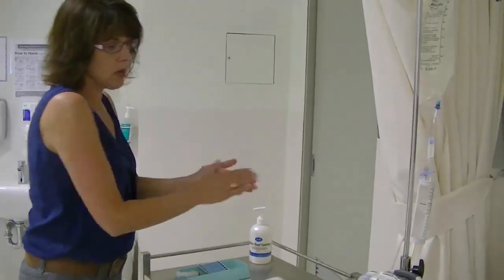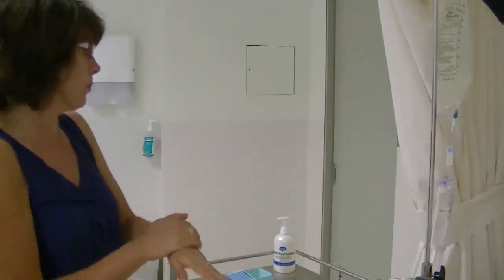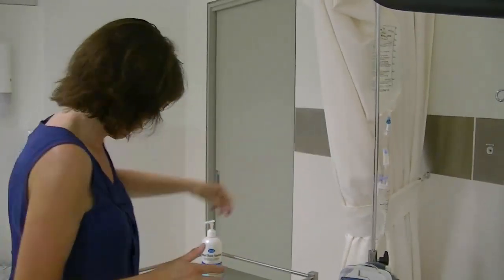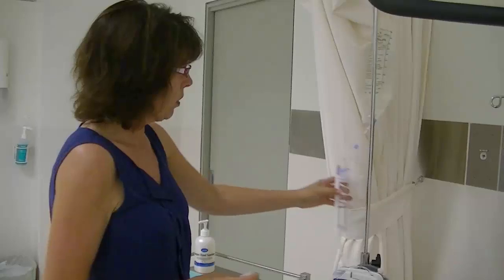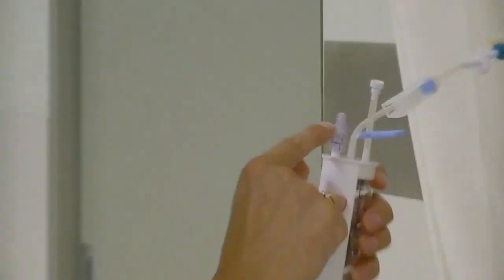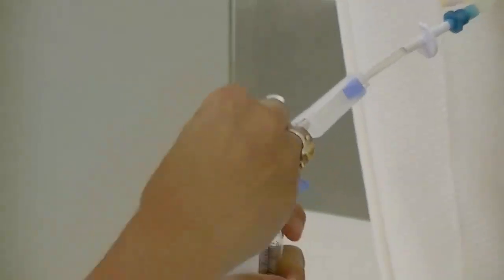Okay, so I've put 70 mils into the burette. I've turned the roller clamp off. The injection port on the burette is this one here. This is the air vent. This does not have a cap, so it sits exposed. So I will swab it with an alcohol swab and leave it for 30 seconds to dry.